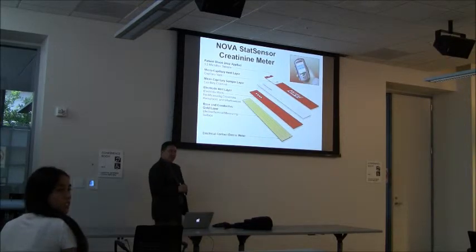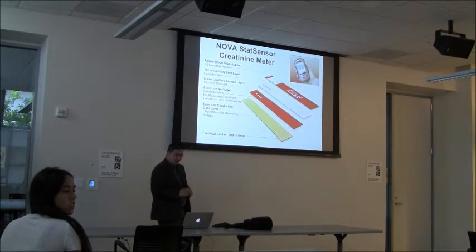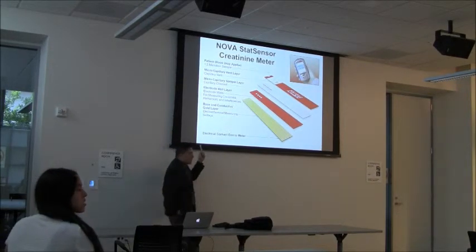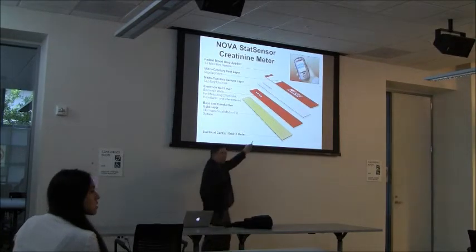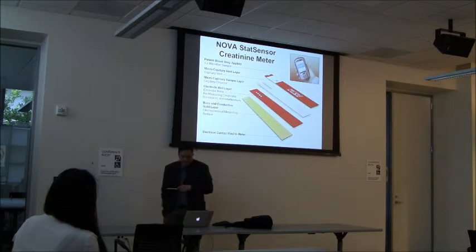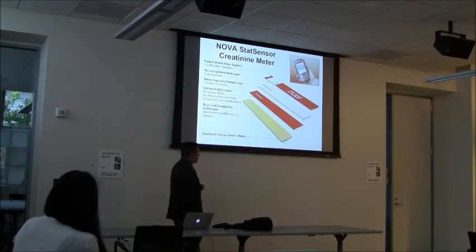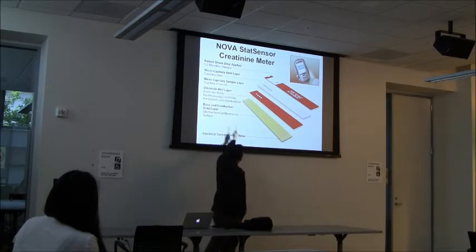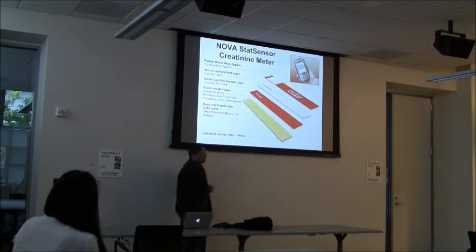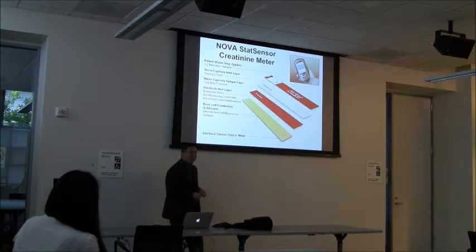I was just curious about what the instrumentation costs, so the upfront buying the instrument, but also the per test cost of the two. Sure, point of care instruments. So these guys, we're probably talking between 80 cents to $1 per strip. So they're pretty cheap, even though they're gold. We joke around we should melt them down and then hopefully make some money off it. My students just finished a study that actually looked at these interferences. She tested about 7,000 measurements over a week, so it's a stack of these gold strips. But they also are contaminated with blood, so we don't want that.